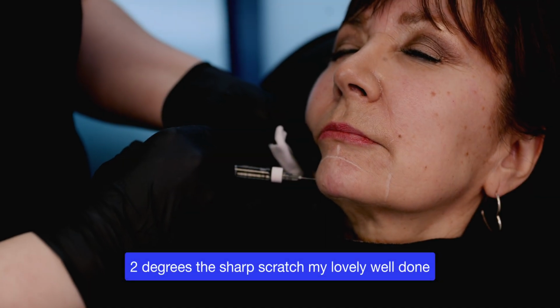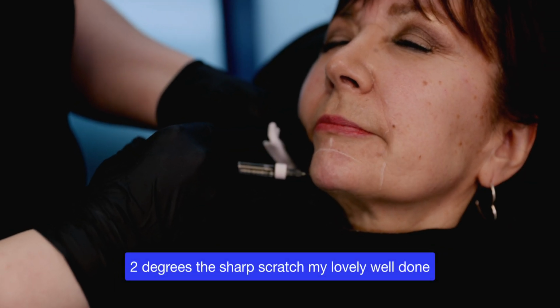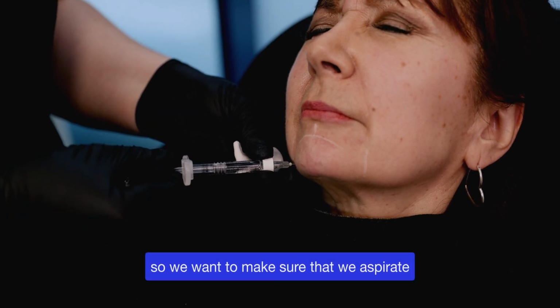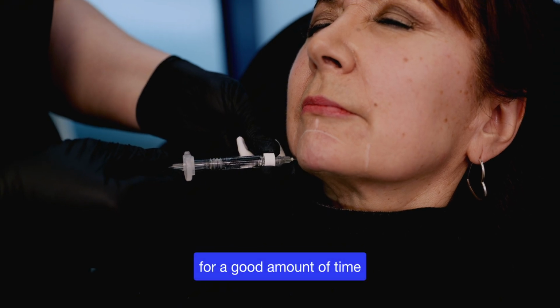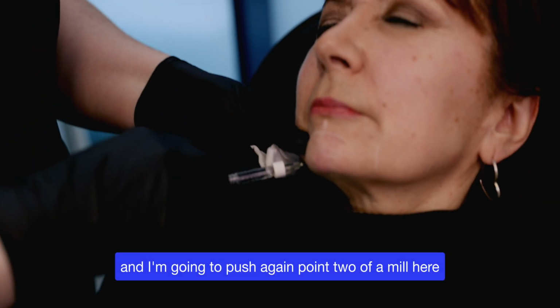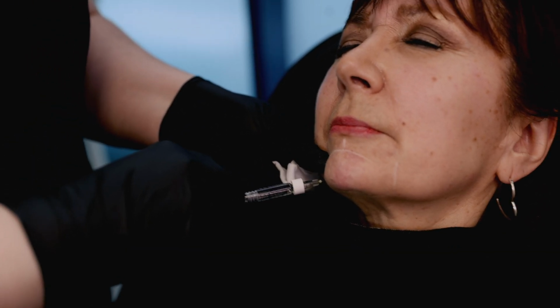Sharp scratch, my lovely. Well done. Now here we do have some arteries that run up the face, so we want to make sure that we aspirate for a good amount of time. Yep, that's fine. And I'm going to push again, 0.2 of a mil here.